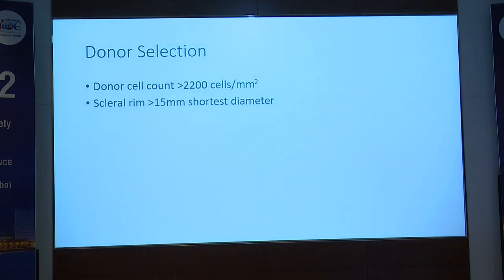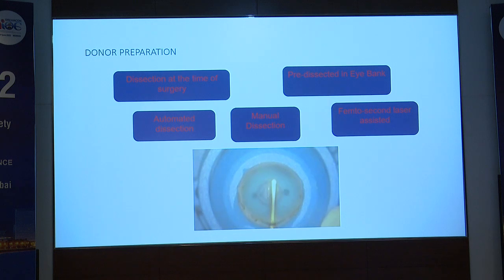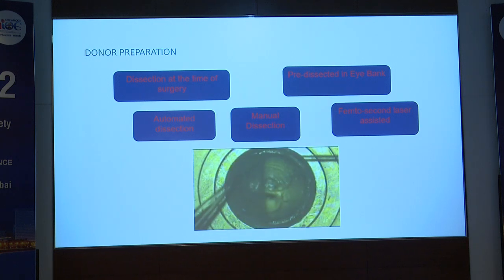So tissue preparation starts with selecting a proper tissue. Usually any donor which we will get from the eye bank, having a donor cell count of more than 2200 cells is good enough. And the scleral rim should be adequate, with the shortest diameter being more than 15 millimeter. Well, today we are really lucky that eye banks prepare DSEK tissues and provide them to us. However, in case we don't have access to a pre-cut tissue, we can still dissect them manually.